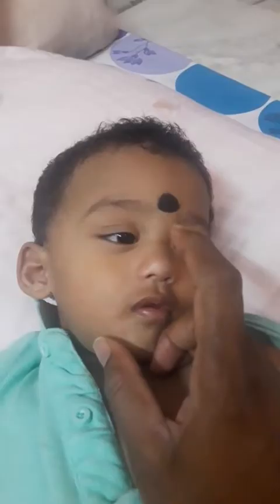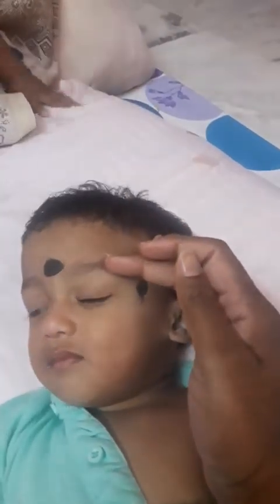So, when you don't find the LOCR, stay in the midline and remove the pathology in polyposis or fungal sinusitis. In osteomas, when you cannot see the eyes of the baby, drill the planum, identify the optic nerve, and then you will get an important landmark. Then you can anticipate just below that, the cheek of the baby, as the paraclival carotid. So this exercise of drilling the planum is useful in osteomas where you cannot find the LOCRs. Okay, thank you.